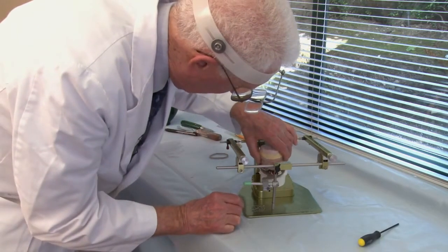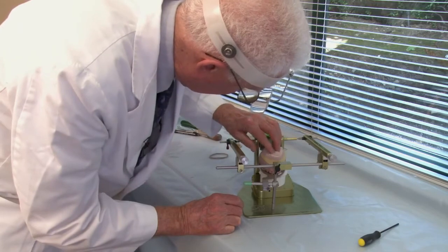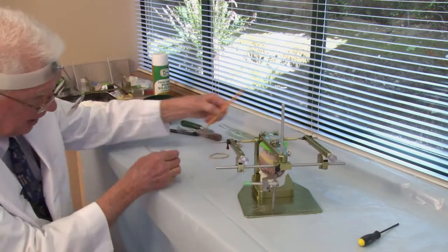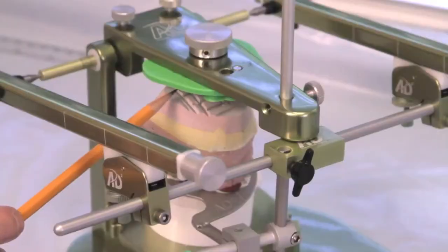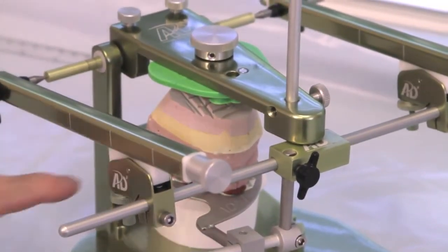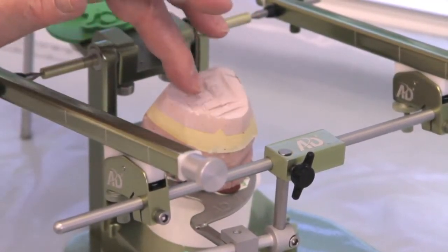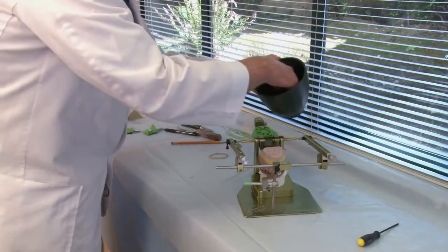So I'll put my upper model on the bite fork, make sure it's seated in the compound correctly, and then I'll close it down, and I'm going to take a look and see how much space there is, how much plaster do I need to mix up to mount my upper model to the hinge axis mounting stand. So there's not too much plaster needed. As always, though, you make sure that you have water, that the model is wet also.